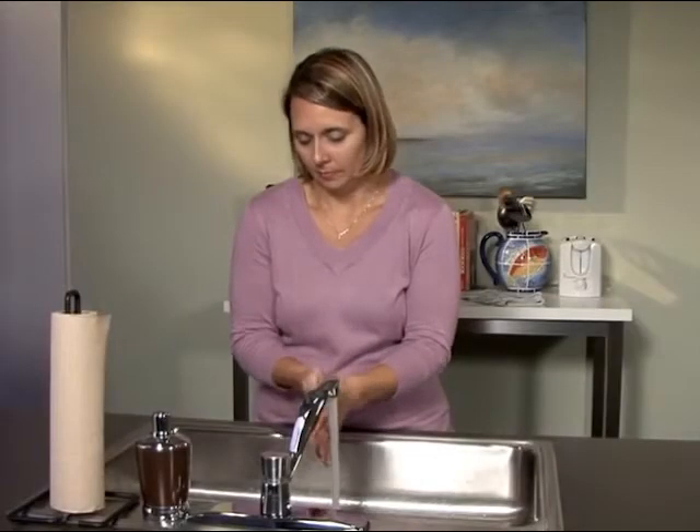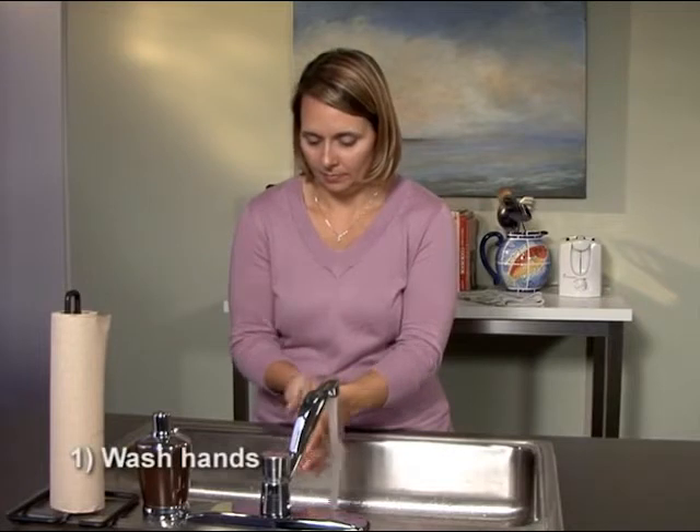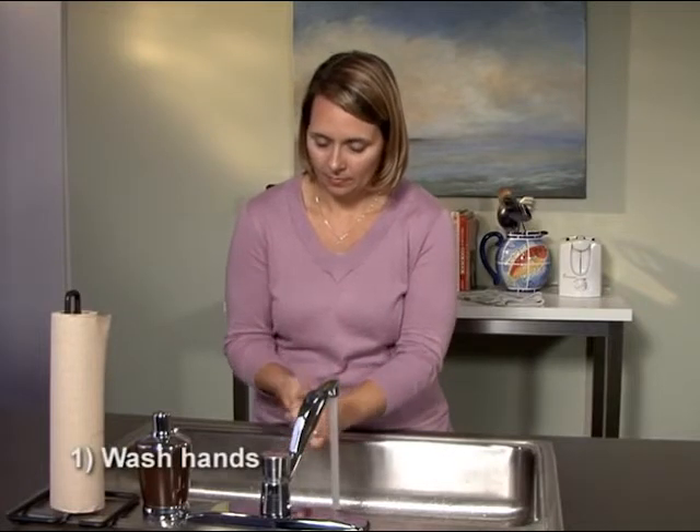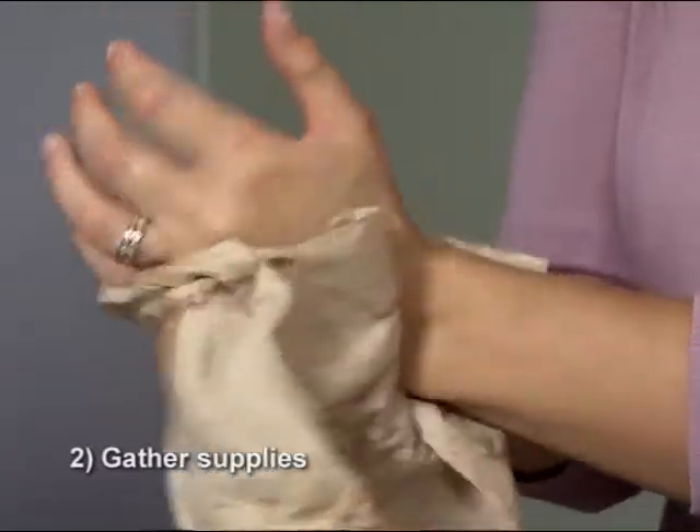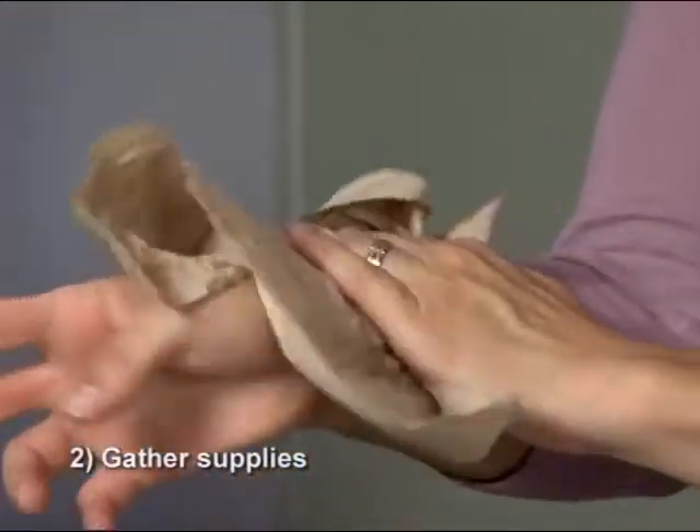Before you gather your supplies, it's important to wash your hands thoroughly using antibacterial soap and water. Once your hands are washed and dried with a paper towel, gather the following items.